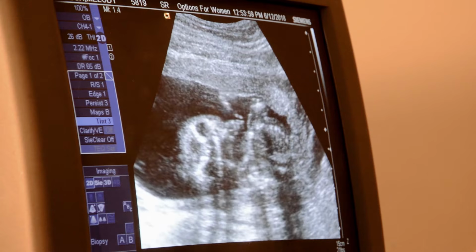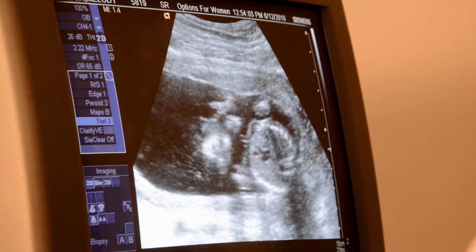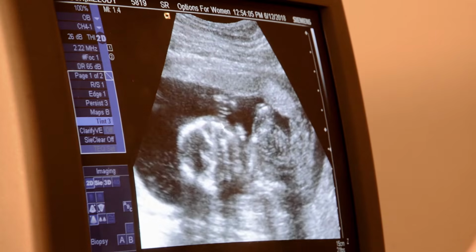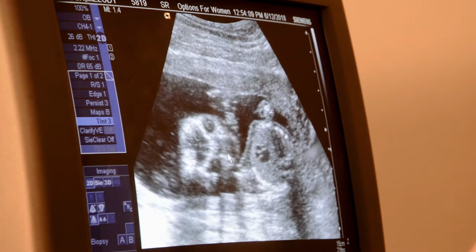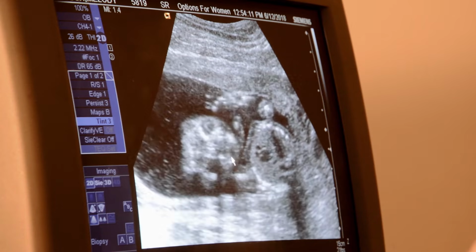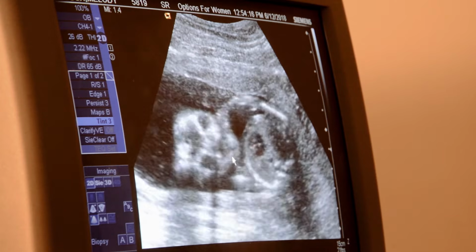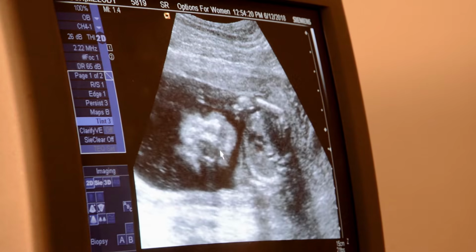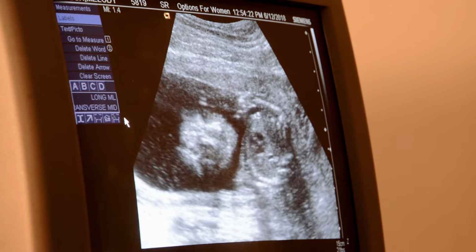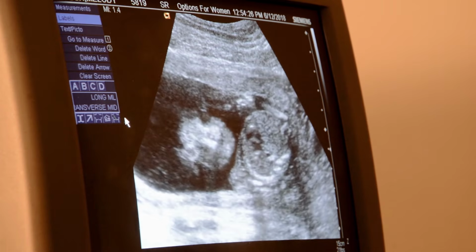Look at him stick his tongue out. And look at that. Oh, did you see that? The hands and the fingers? Yeah. Oh my goodness. Look at that. There, look at him. Oh, did you see the mouth? I like that. Oh. Watch this. He's going to open his mouth.